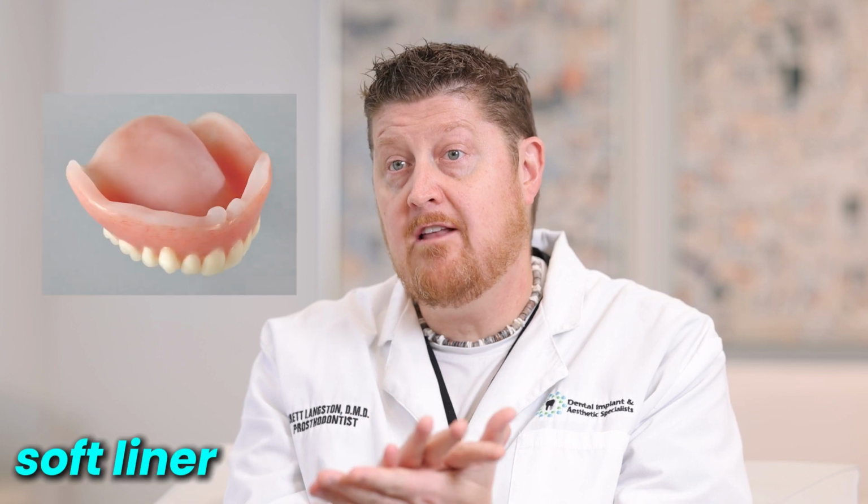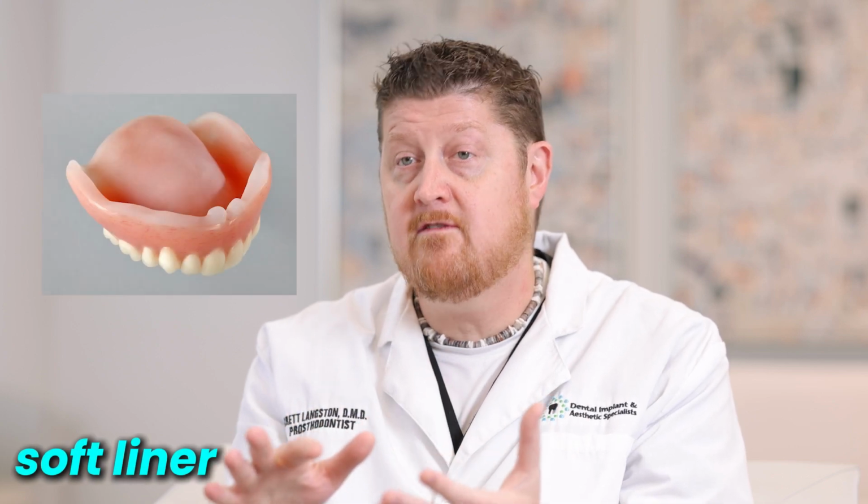And this whole time, for the first 7 to 10 days, your mouth is sore. It's irritated. It's not a happy time for the mouth. So those first 10 to 14 days are definitely the hardest. But the nice thing is, once we reach that 2-week mark and the sites where the teeth were taken out have healed over, I can put a soft liner in that denture and it fits so much more comfortably. And at that point on, that's when the process gets a lot better.